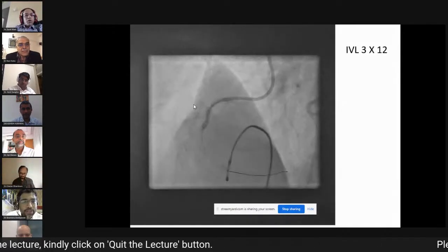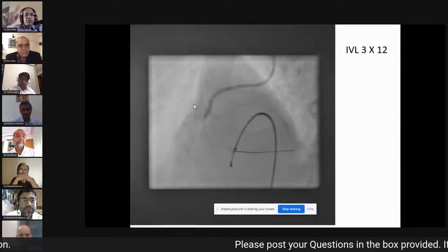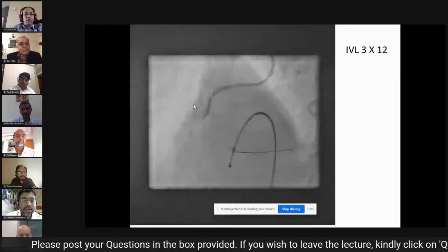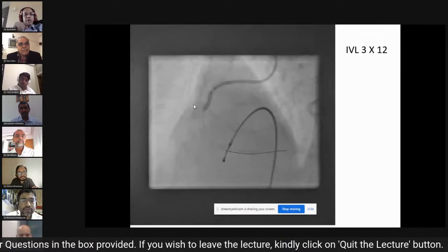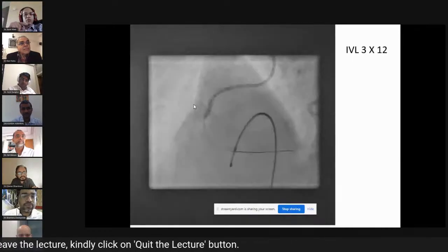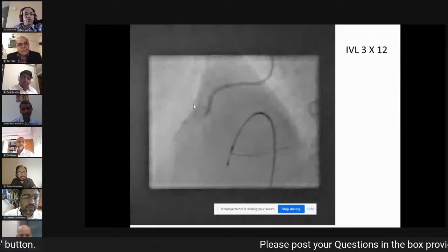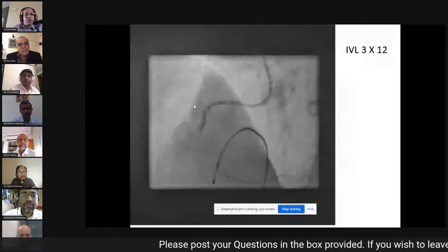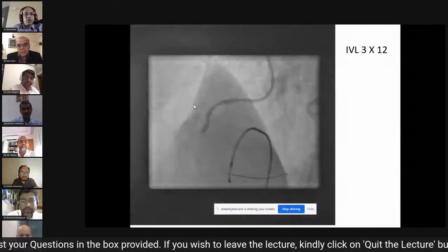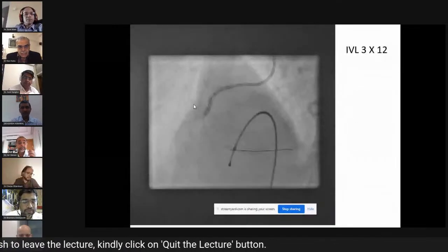So, with Shataru, I agree with the guideliner. What you're saying is if you get the OCT catheter, you would see better and you would decide the strategy accordingly. And the other problem with rota in a bend and stent is that if you do a rota, the stuck burr is a possibility in this situation. So you should always keep in mind, before you take in rota, which I agree with Ashish, that's why he was worried to go ahead upfront with rota. If you had seen with the OCT, you would definitely understand what this is.